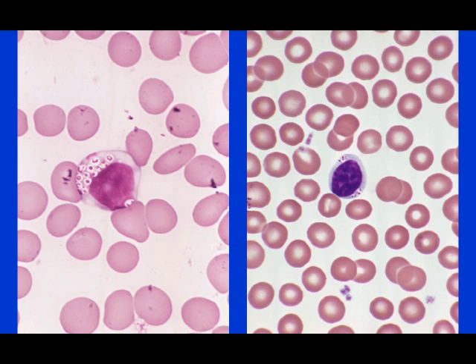And here we have examples from 2 different patients with lymphocytes with inclusions. On the left, the classic, described as looking like Chinese letters. I think they only look like Chinese letters to somebody who does not speak or read Chinese, but in any case, that's how they've been described in the literature. And they have these very profound vacuoles around the mucopolysaccharide inclusions, allowing their recognition.